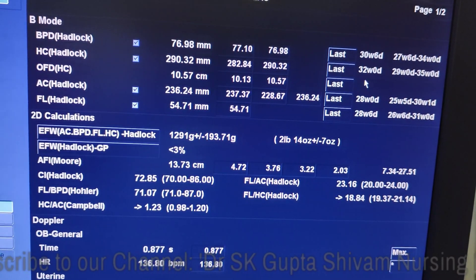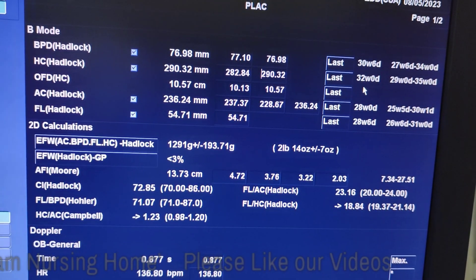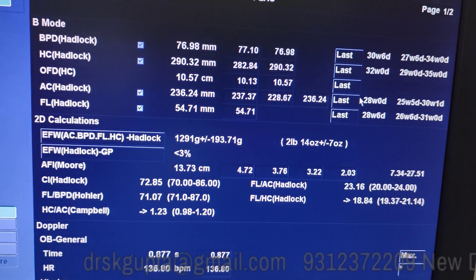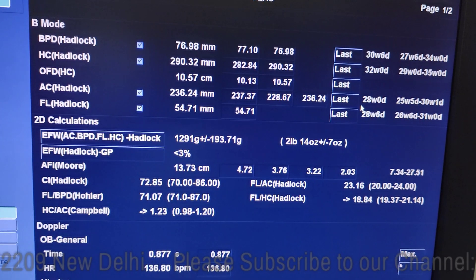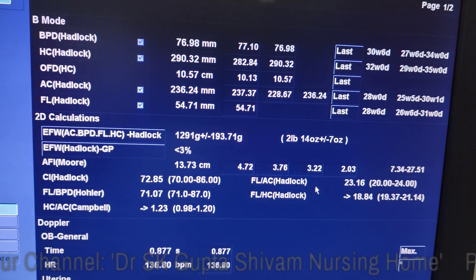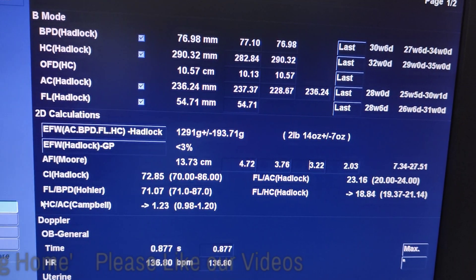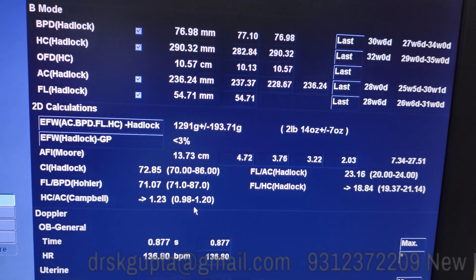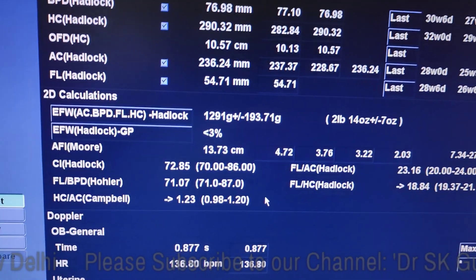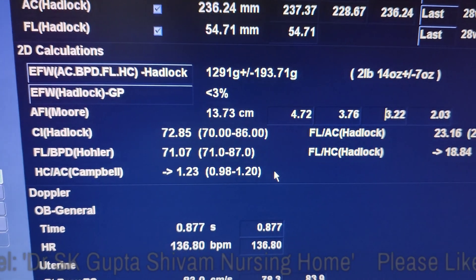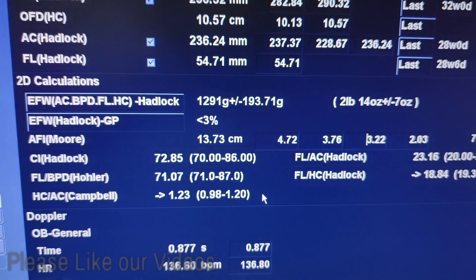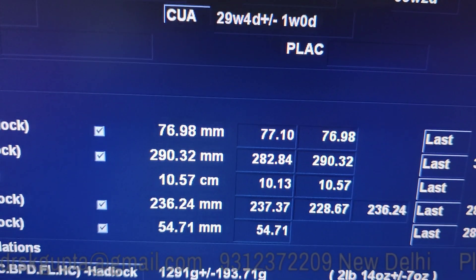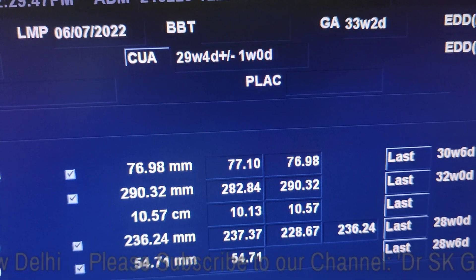When we measured the various parameters, we found that the BPD is giving a gestational age of around 31 weeks, while the abdominal circumference is giving a gestational age of around 28 weeks and the femoral length is also giving a smaller gestational age of around 29 weeks. In such cases, when IUGR occurs in the third trimester, the HC-AC ratio should be seen. The head circumference is more and the abdominal circumference becomes less. You can see that the HC-AC ratio is 1.23 while the normal is up to 1.2.